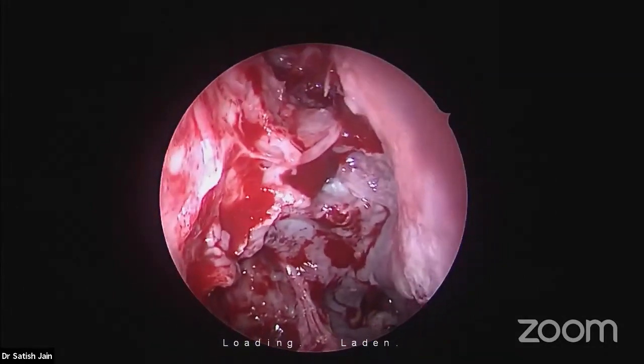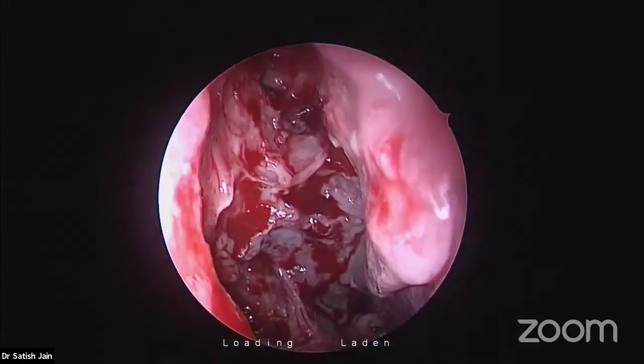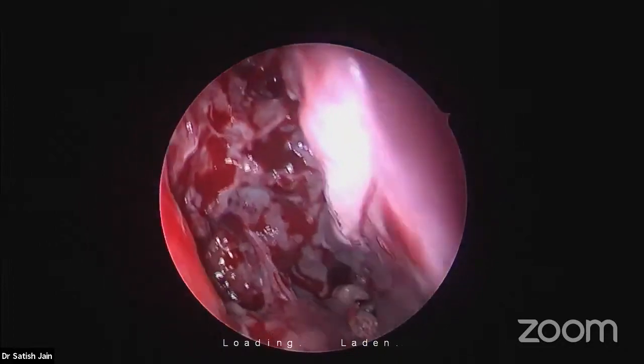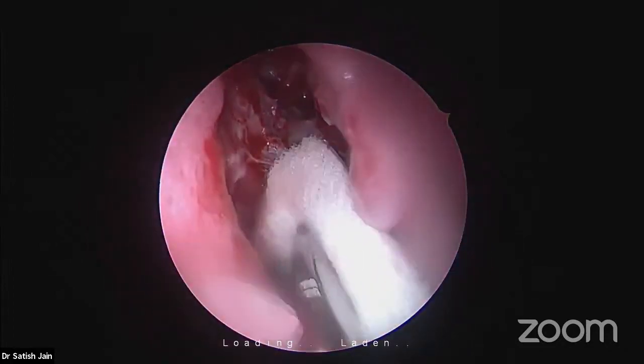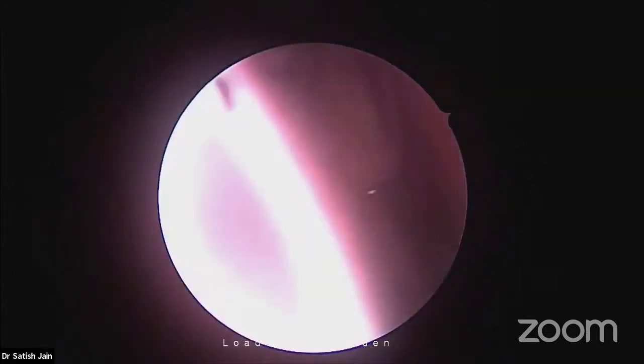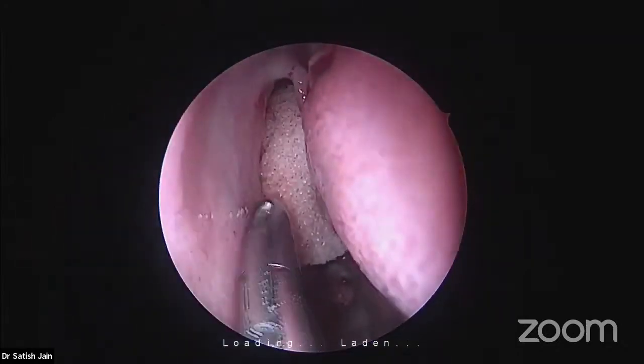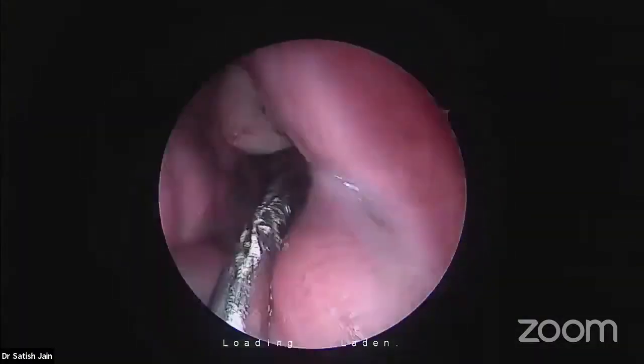Can you see the ground lamella completely? How to know whether there is any retrobullar recess present or not? It was the retrobullar recess where I fractured the bulla from behind. Just before, when somebody asked about the hiatus semilunaris superioris, I went into that. Behind that was the retrobullar recess, and I fractured from behind anteriorly to get the bulla out.